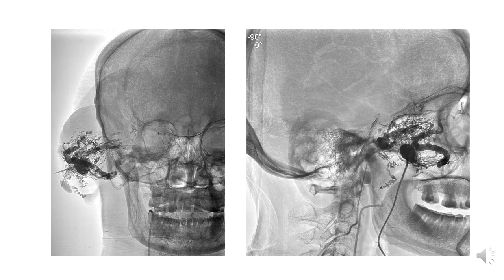The vessel there has ruptured. This is not an uncommon finding in these kind of tumors. They are not high flow AVMs, so this happens. We try to avoid it, but it happens, and usually it does not cause a lot of problems. We have very nice percolation into a lot of blood vessels in this particular tumor, and so I'm satisfied with the way the embolization has progressed till now.